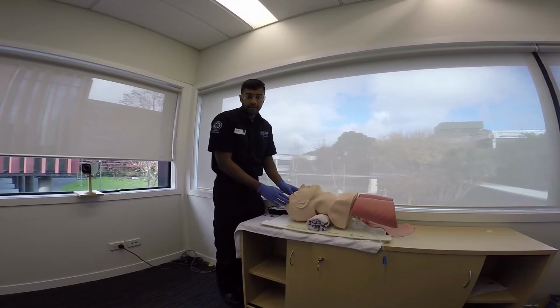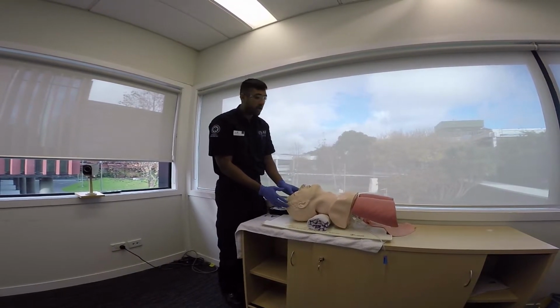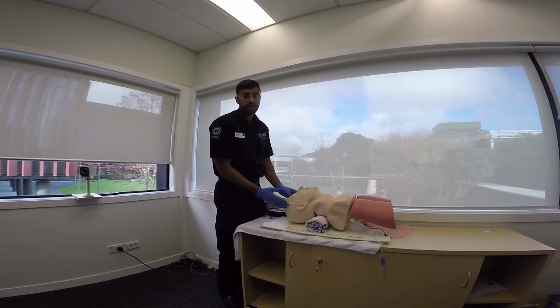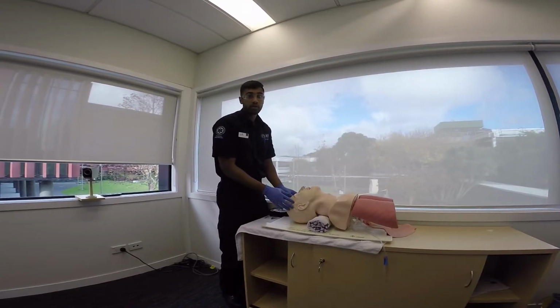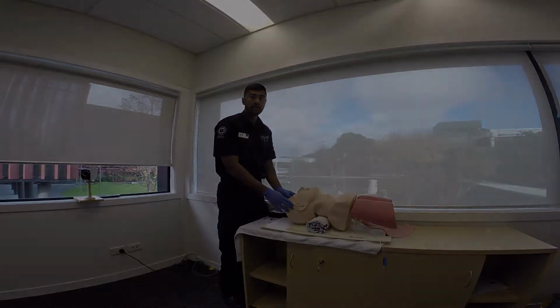Benefits of using an NPA are that they do not induce vomiting and can be placed in a patient with a high GCS score, as well as patients with trismus. Complications can include epistaxis or nasal polyps, as well as it could be contraindicated in the setting of a TBI, which is a traumatic brain injury.